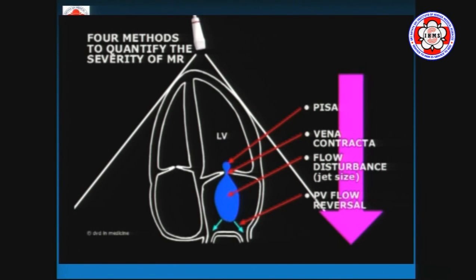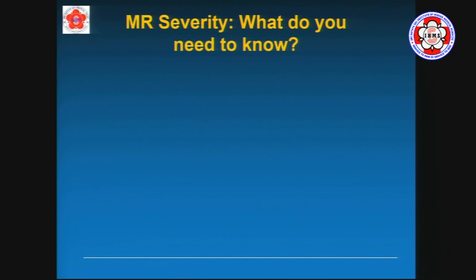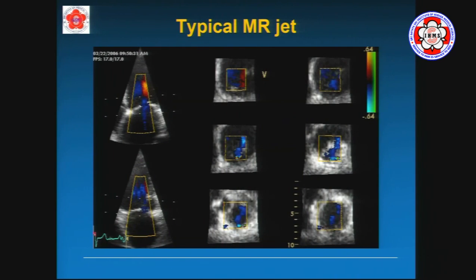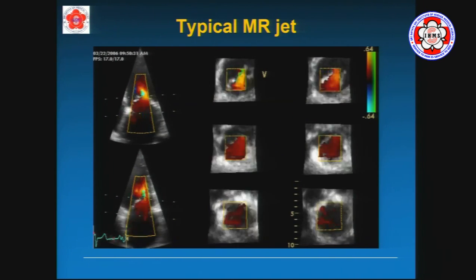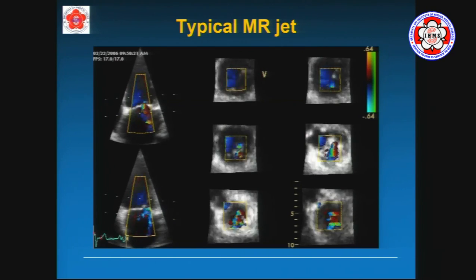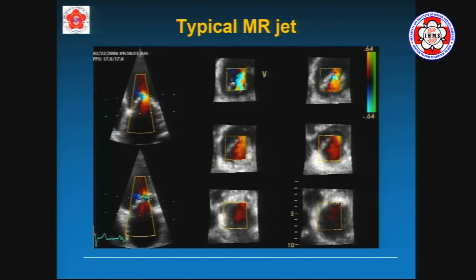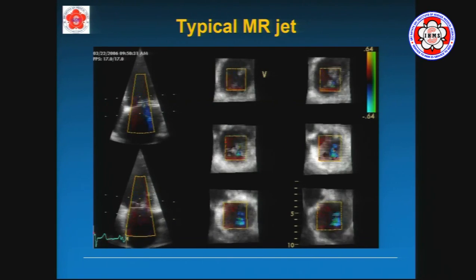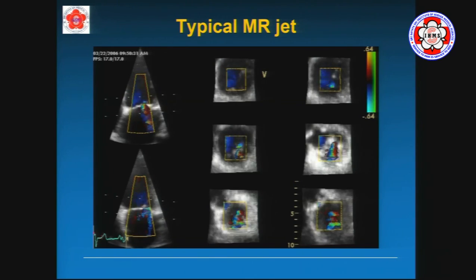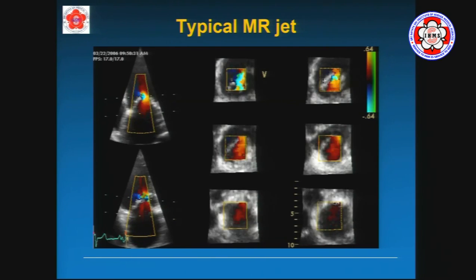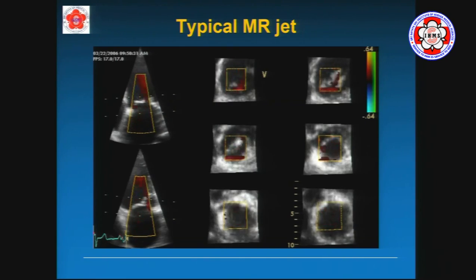When we quantify mitral regurgitation, all three of those components can be used to give you the grading — whether it's 1+, 2+, 3+, or mild, moderate, severe. We can do all sorts of things when we look at a particular type of valve. Here's an example of the apical four-chamber view showing a biologic regurgitation jet. And if we do 3D echo, we can actually slice this in different settings to show it across in different formats.